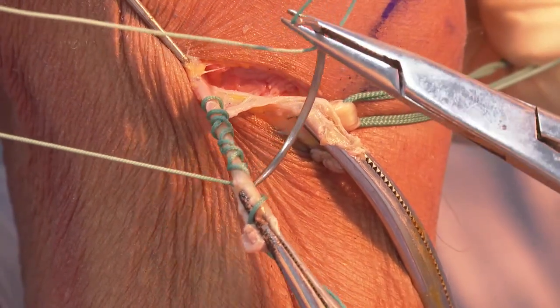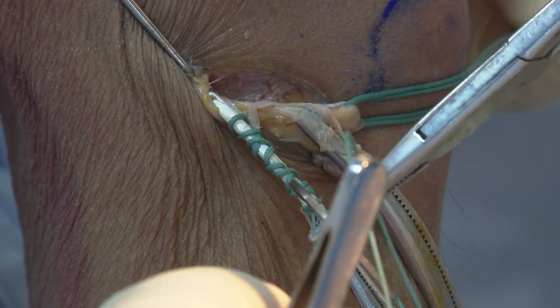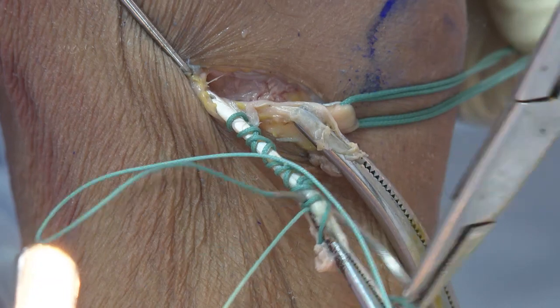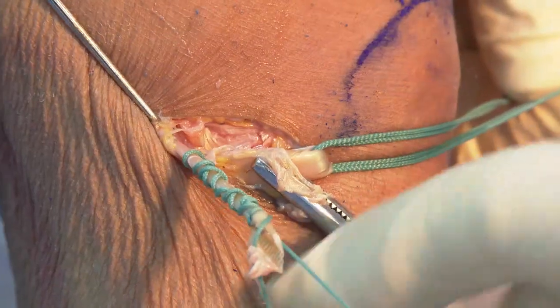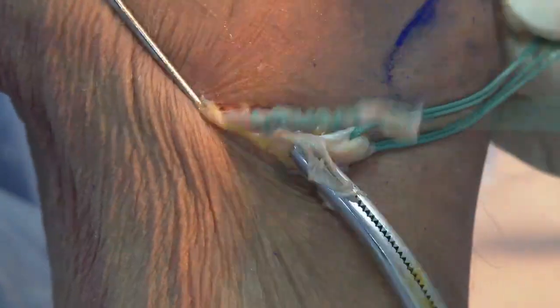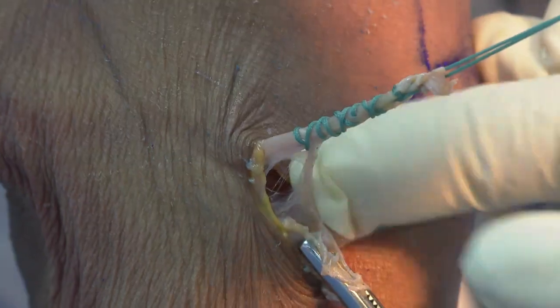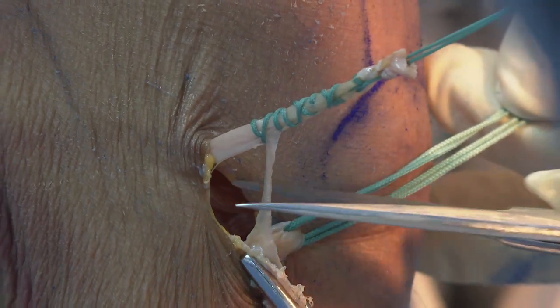Even if the tendon is small, with this method it's not easy to damage the tendon. And then you finish with the Mason Allen stitch. You go vertical, like Mason Allen, and then pass it out like that. So you do not cut through the tendon, okay? Because you lock the tendon, okay? Transverse, vertical, like Mason Allen, okay? Good. So now you see that it's very strong. It's not cut through, okay? So, good, we get that first tendon.